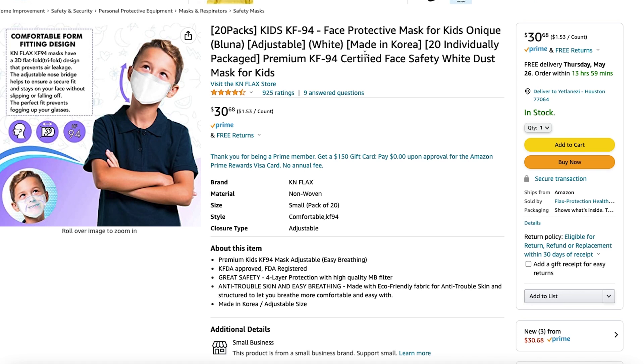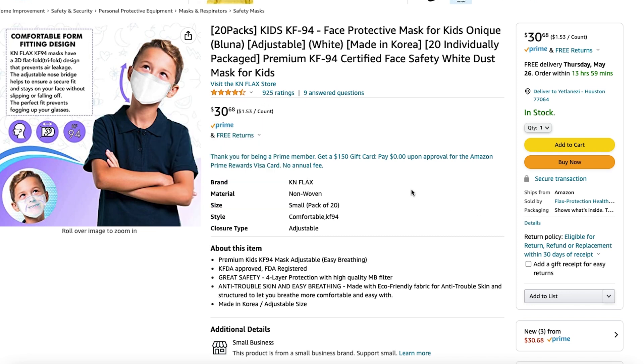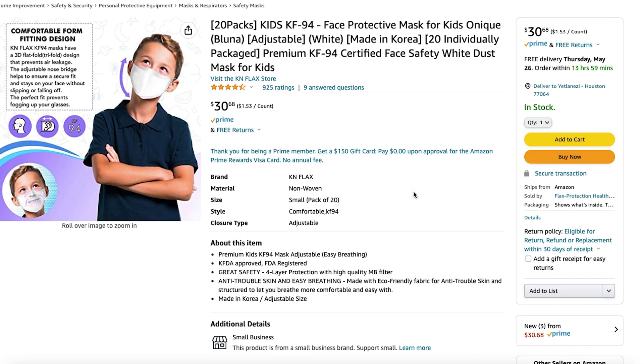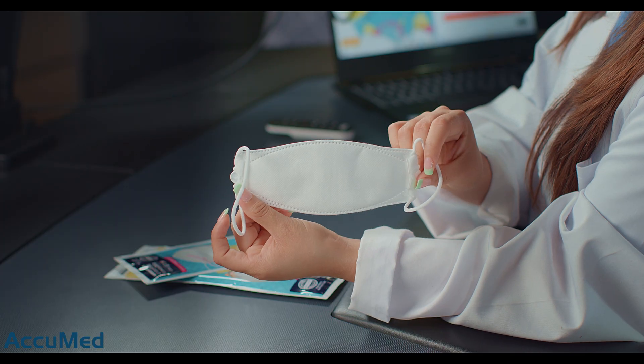Here is the Amazon listing where we purchased these KF94. They currently cost $30.68. They also have a 4.4 out of 5 rating with 925 reviews, and they state on their listing that they are KFDA approved and FDA registered. Let's go ahead and open this up and see how they look.